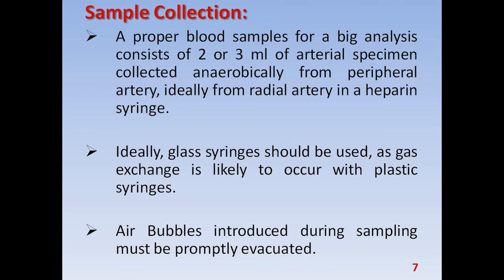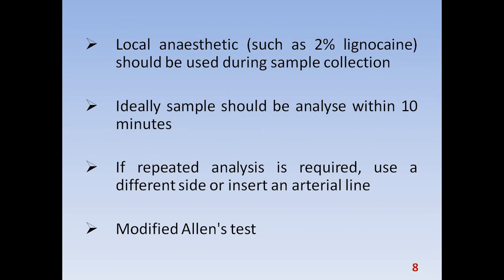Now, ideally, glass syringes are preferred because gas exchange may occur in a plastic syringe. Now, bubbles should be evacuated promptly. Now, local anesthetics such as lignocaine can be used during sample collection, and ideally, samples should be analyzed within 10 minutes after collection.